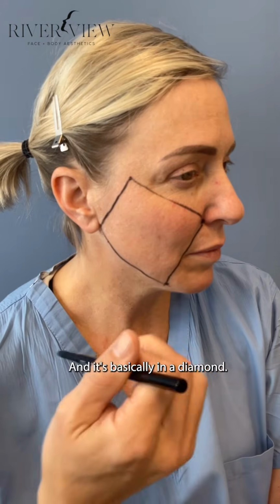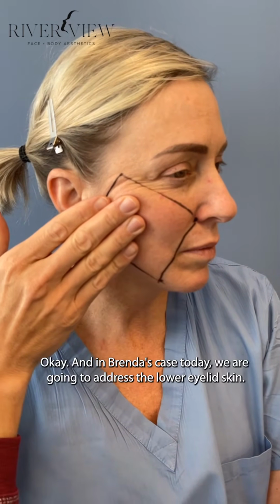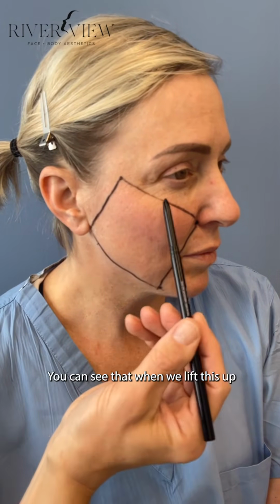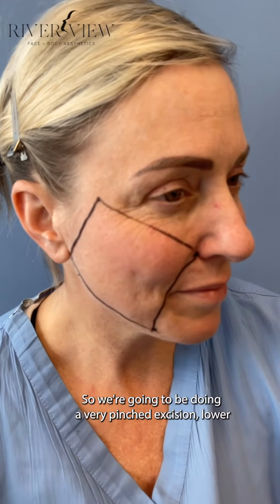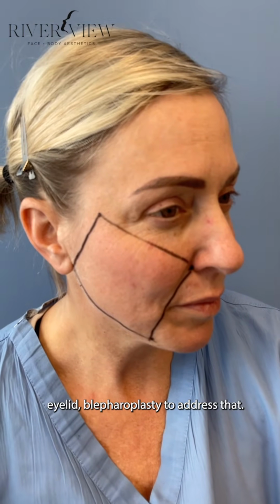And it's basically in a diamond. So we're gonna be lifting this diamond back up, okay? And in Brenda's case today, we are gonna address the lower eyelid skin. You can see that when we lift this up, or when she smiles, for example, she gets this extra lower eyelid skin. So we're gonna be doing a very pinch excision, lower eyelid blepharoplasty to address that.